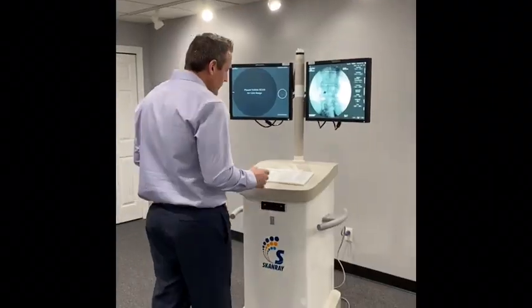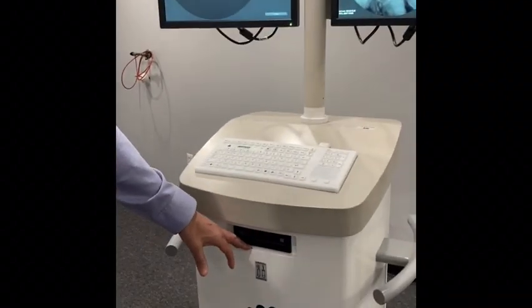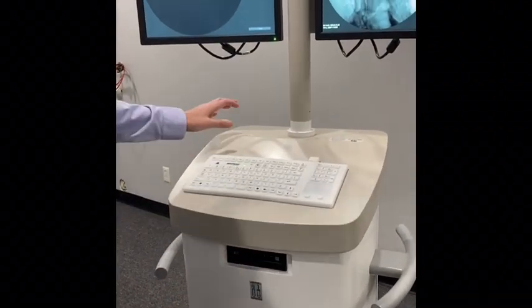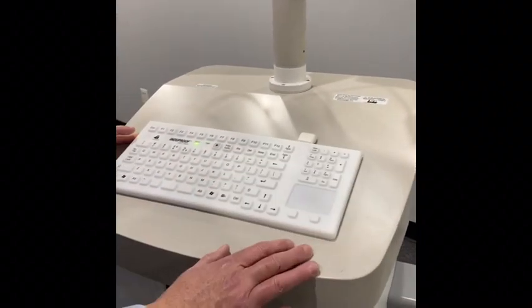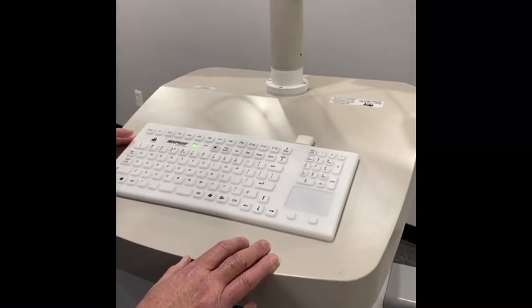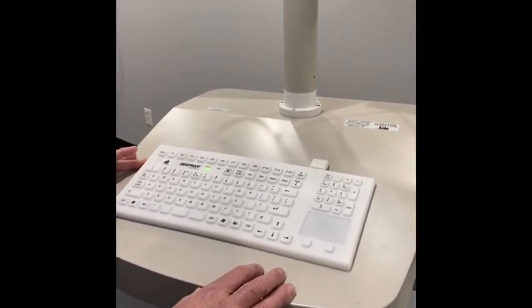We're going to move over to the computer station. Looking at the computer station, we have CD burning, two USB ports in the back, and a washable keyboard and mouse in case you spill anything — it cleans up very easily. We have 1 terabyte of memory, which will hold about 2 million images.